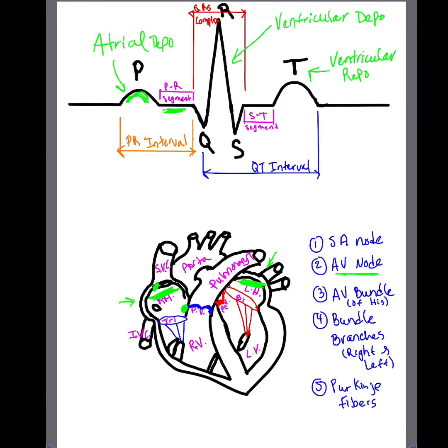The third step is the atrial repolarization and therefore the ventricular depolarization. And the ventricular depolarization begins at the apex of the heart, causing the QRS complex. So this part right here of the EKG. And now also atrial repolarization occurs. I'm going to represent atrial repolarization in orange.